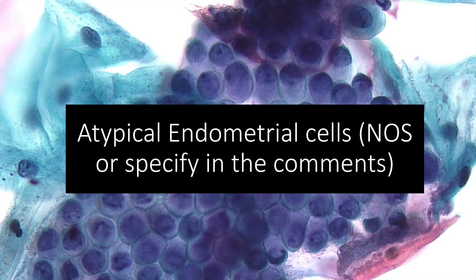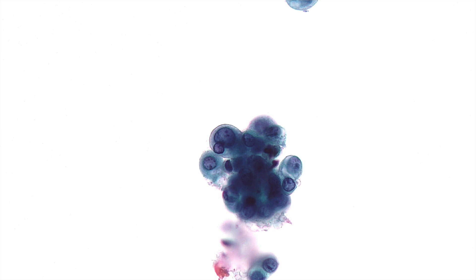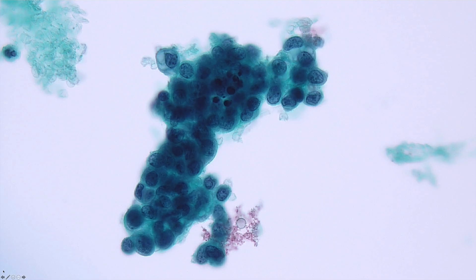Now we'll cover atypical endometrial cells. Distinction of cytologically benign from atypical endometrial cells is based primarily on cell size. Atypical endometrial cells are not designated as favor neoplastic; they are typically present in small groups. These cells show some hyperchromasia and slightly enlarged nuclei with relatively scant cytoplasm and ill-defined cell borders. Cytoplasm can be vacuolated. Atypical endometrial cells can be associated with a variety of intrauterine processes, including polyps, endometritis, hyperplasia, and carcinoma.